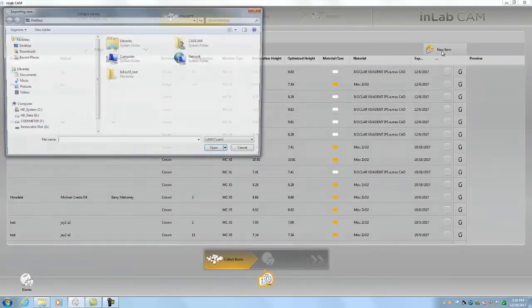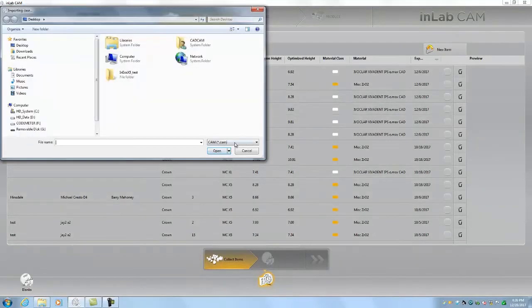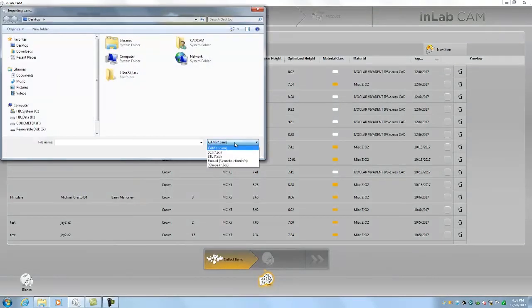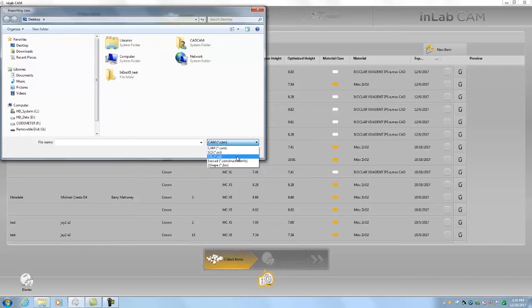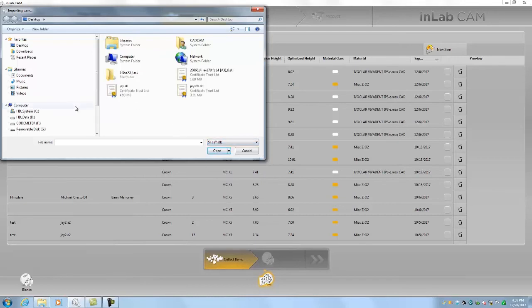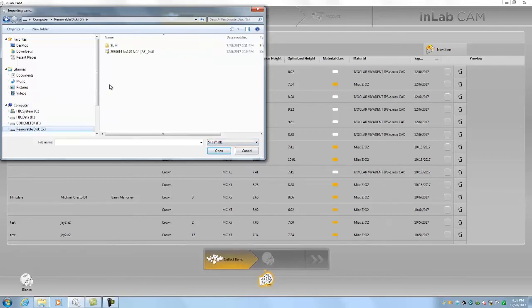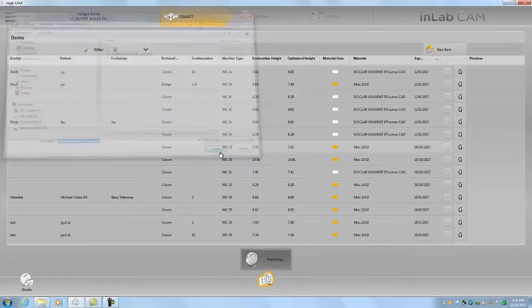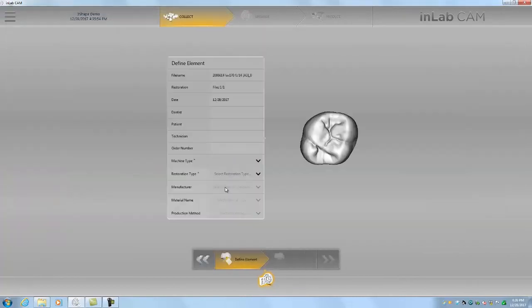You can see here in this dropdown I can import CAM files, SCI, STL, construction info files from exocad, and 3ox files from 3-shape. In our case we're going to do STL file. I'm going to go to my G drive and select my STL file. Click open and there's my crown.